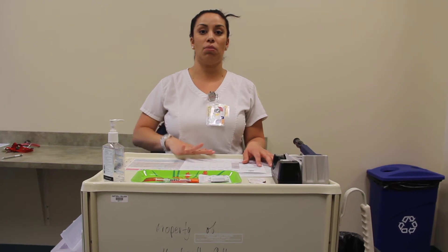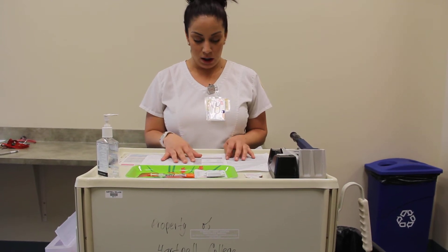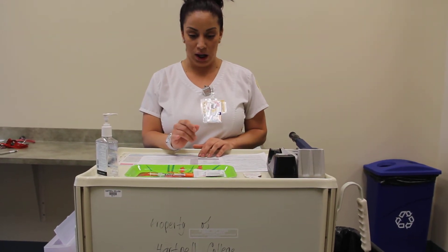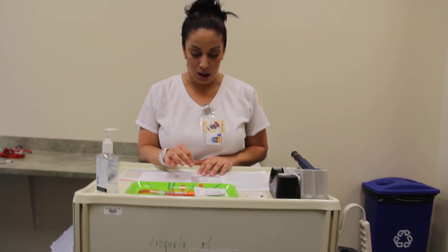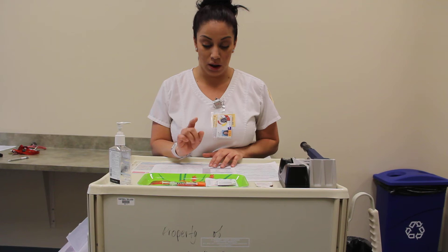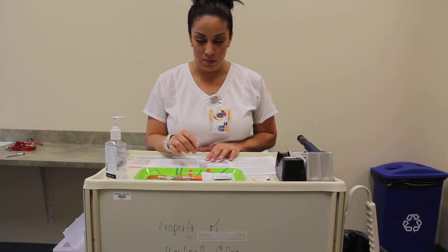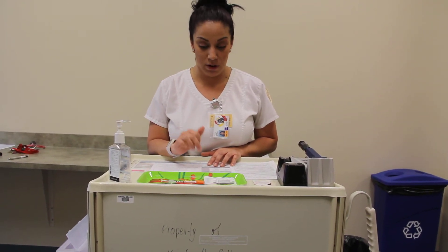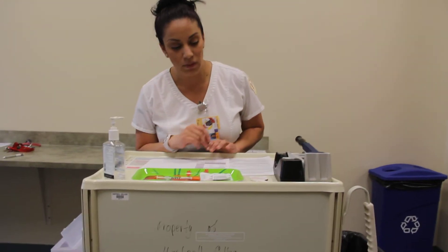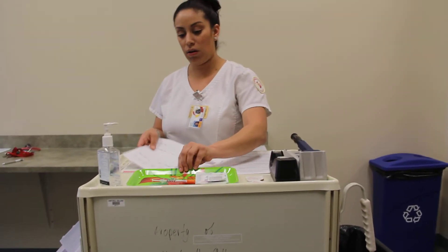I'm going to do my five rights one more time before I leave the cart and go into the patient's room. Right patient is Mary Smith, right drug is NPH and regular insulin, right dose is three units of regular and 12 units of NPH for a total of 15 units, right route is sub-Q, and right time is 900. I'm ready to give my medication. I'm going to take the MAR with me — you have to take it with you at all times when you take your medications.